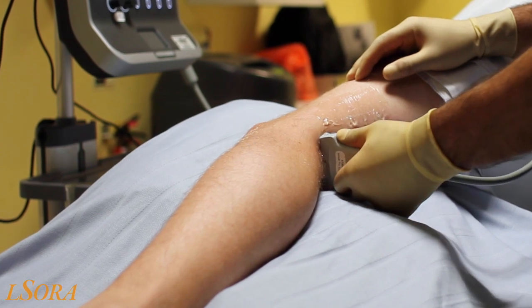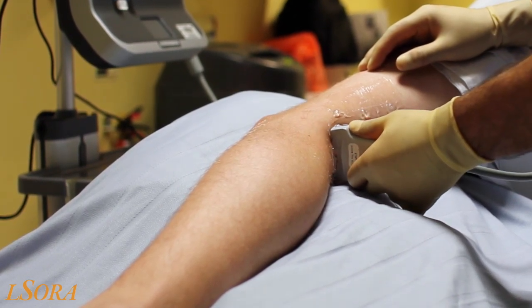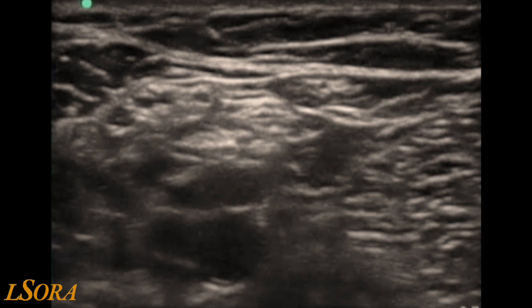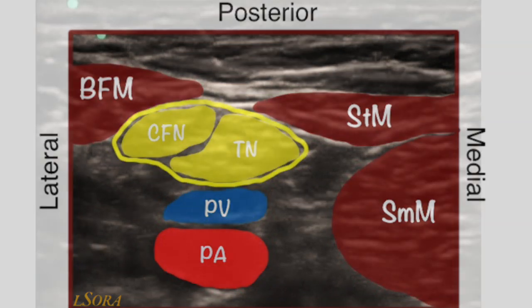A high-frequency linear probe is placed in the area behind the popliteal fossa. If you look at the image here, superficially at the top of the screen, you will see skin and subcutaneous tissue. To the left-hand side, or the lateral part of the patient image, you will see the muscle bulk made up of biceps femoris. To the right-hand side, you will see the muscle bulk made up of the semitendinosus and semimembranosus muscles.